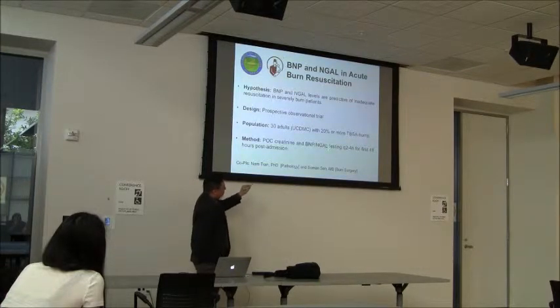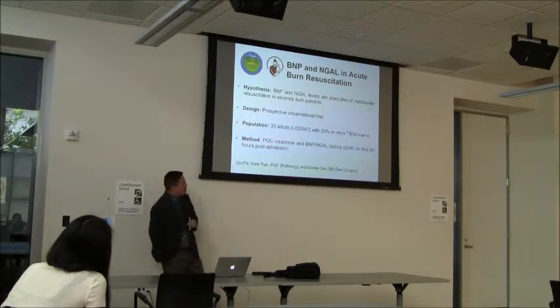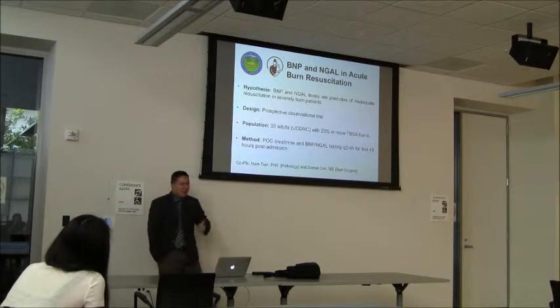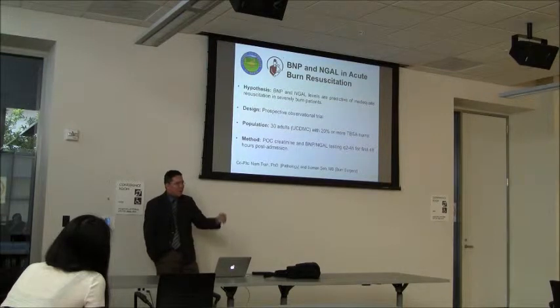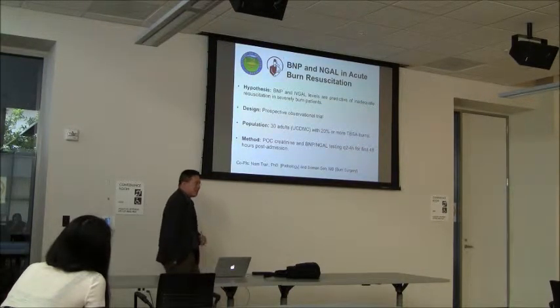And this is what made my staff members hate me for about a year. They had to test every 2 to 4 hours for 48 hours upon admission. So my two or three researchers were on call, waiting for that burn patient to come in, and they started testing immediately every 2 hours, and they were on 8 and 12-hour shifts to make sure it finished. So very, very challenging study. We finished it and we're very happy about that.